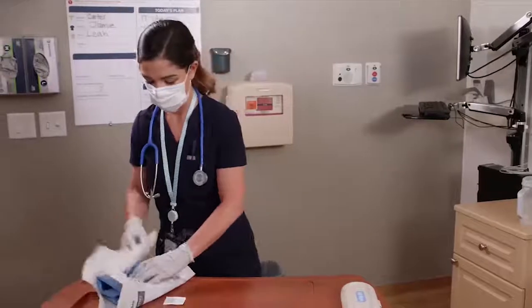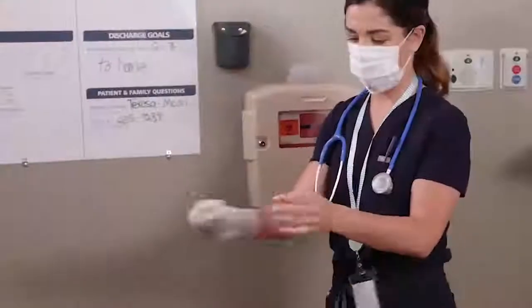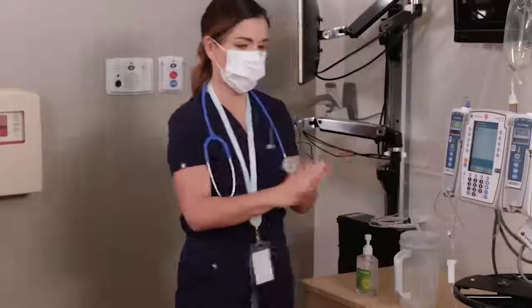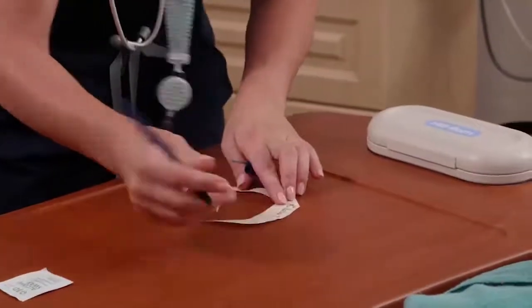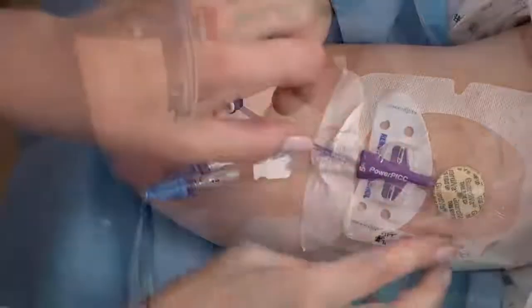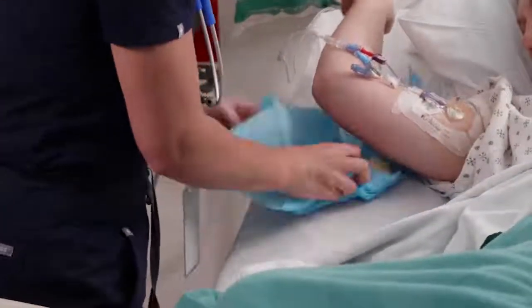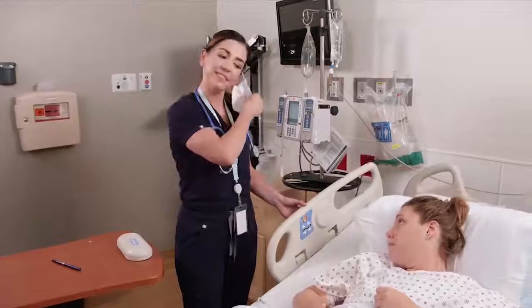Once you're finished, discard used supplies in appropriate containers. Remove gloves. Perform hand hygiene. And remember to label the dressing with the date, utilizing the provided dressing label. Document the procedure in the patient's medical record, taking note of insertion site, catheter external position, any remarkable signs and symptoms of complications, and how the patient tolerated the procedure.